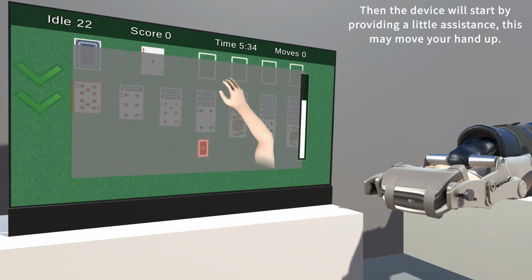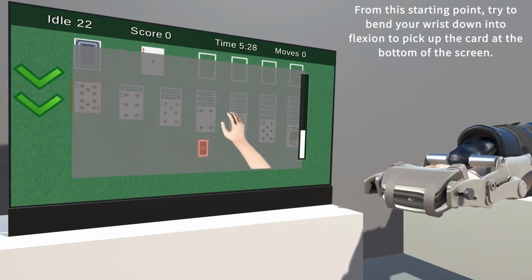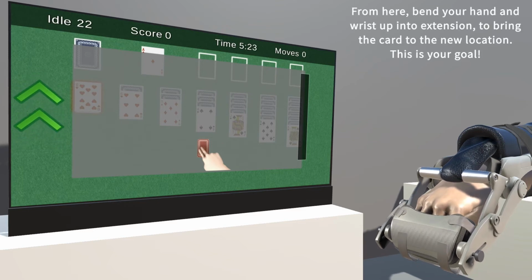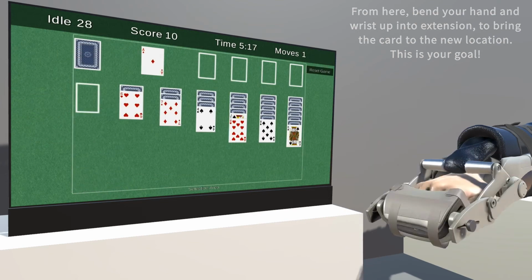The device will start by providing a little bit of assistance. This may move your hand up. From this starting point, try to bend your wrist down into flexion to pick up the card at the bottom of the screen. From here, bend your wrist up into extension to bring the card to its new location. This is your goal.